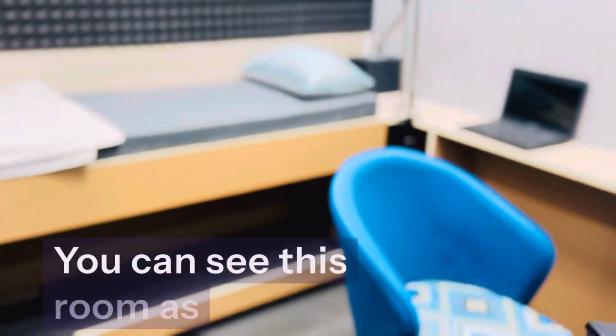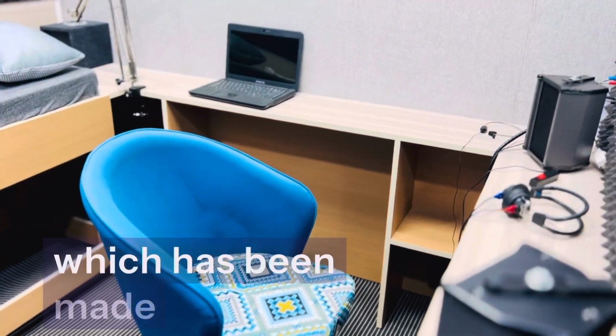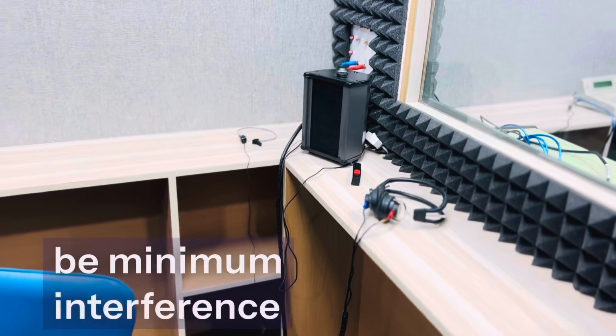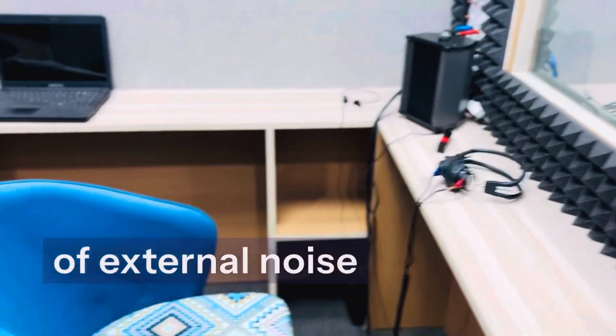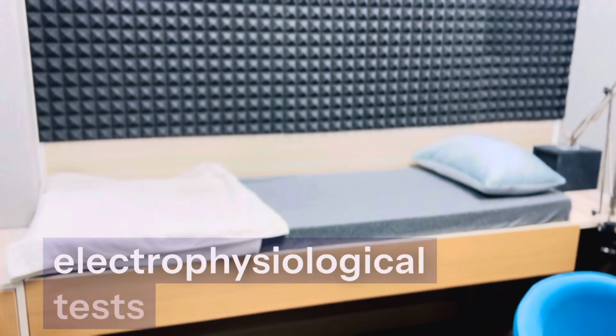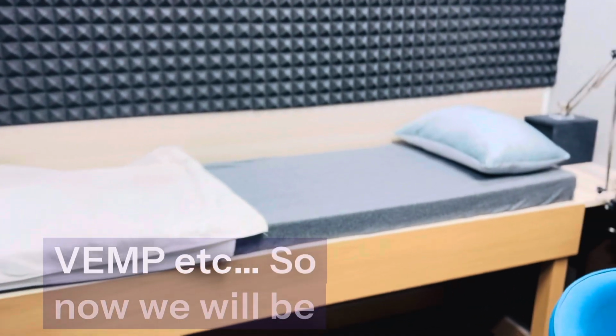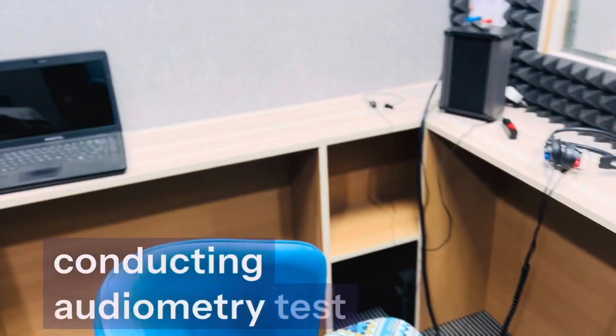You can see this room is a sound treated room, which has been made so that there is minimum interference of external noise. So the patient is going to sit over here, and the examiner is going to sit on this chair, and this is also the bed for the electrophysiological tests, which are BERA, ASSR, ECOG, VEMP. So now we will be conducting the audiometry test with this.